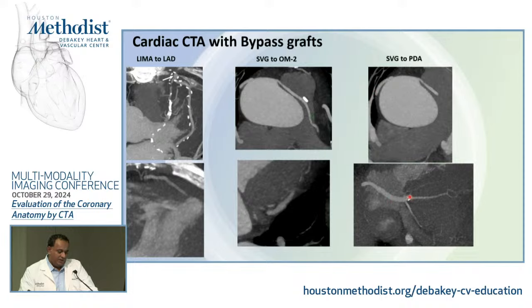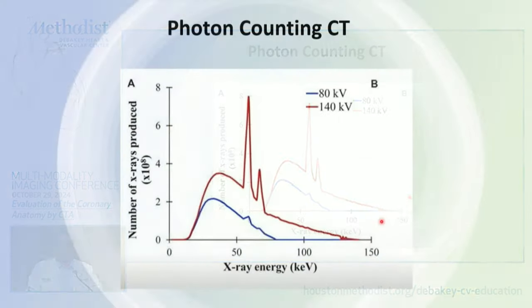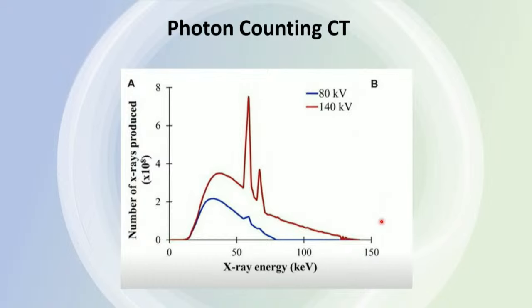headed to a PDA. All right, let's talk about photon counting CT, which is getting installed in the Smith Tower or OPC Tower as we speak. All right, so what is photon counting CT? You guys have all heard the name.